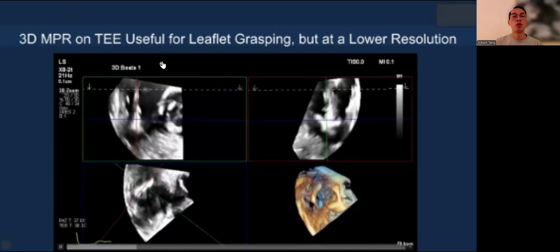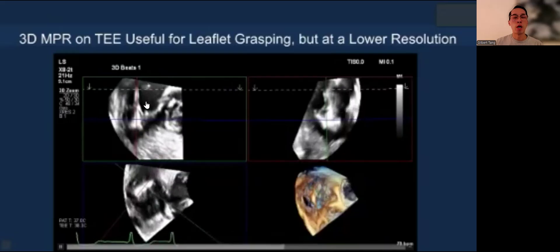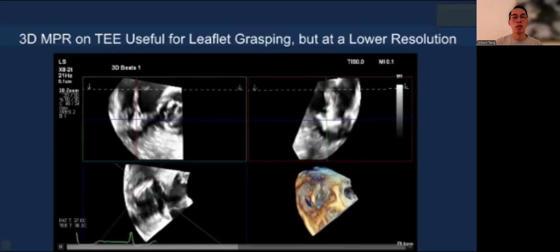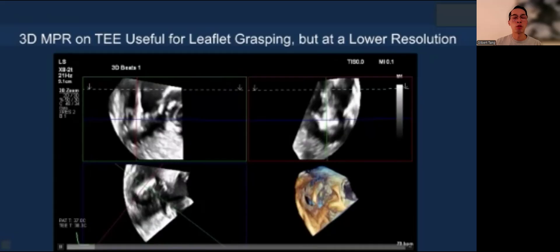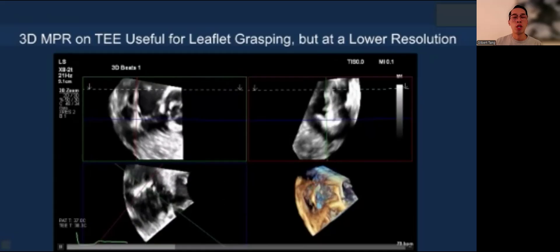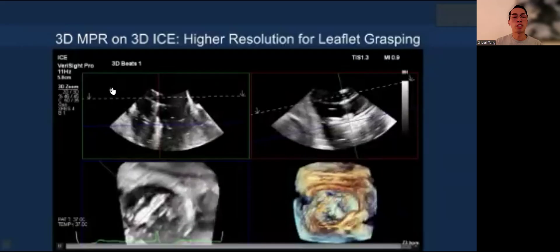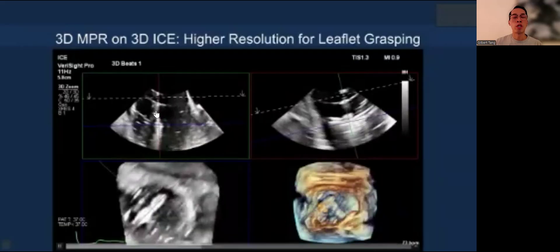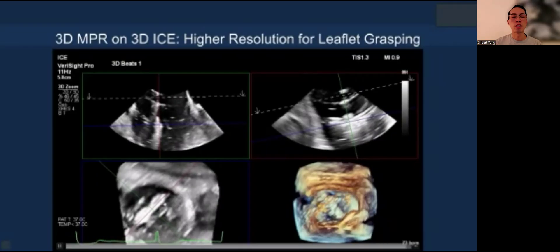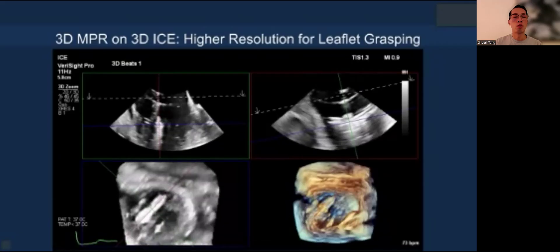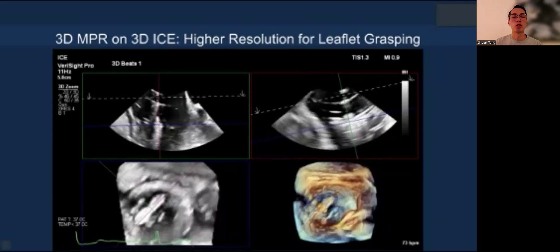You can use TEE or ICE for this. The green box shows the RV inflow view to check trajectory, the red box shows the grasping view with the leaflets, and the blue box shows the clip orientation in the transgastric view. This allows you to simultaneously optimize orientation, grasping, and leaflet insertion confirmation. On 3D ICE, exactly the same workflow applies — green box showing the inflow view, red box showing the grasping view, and blue box showing the clip orientation in transgastric, so you can do all three at the same time to optimize grasping, avoid a side bite, and confirm insertion.